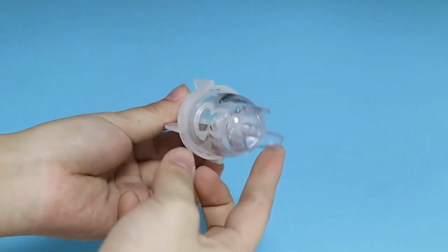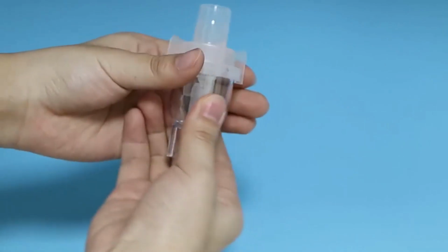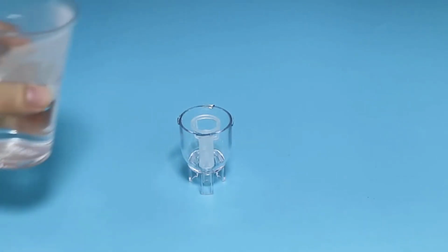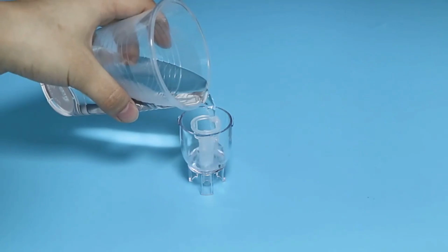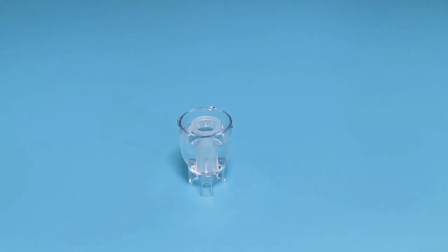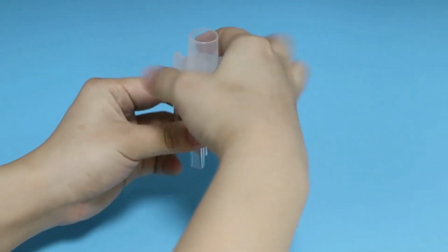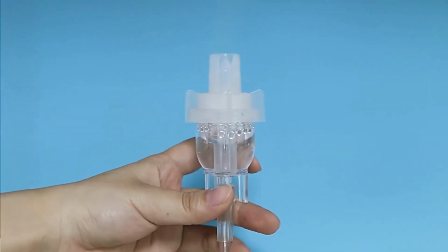Medications used to treat respiratory conditions such as asthma, cystic fibrosis, and chronic obstructive pulmonary disease, COPD, are sometimes given via nebulizer machine. Nebulizers include a container to hold liquid medicine, an air compressor to generate airflow and turn the liquid into mist, and a mouthpiece or mask. They can be easier to use than inhalers for some people, including young children and people with severe respiratory conditions. This is because they do not require a specific breathing technique.